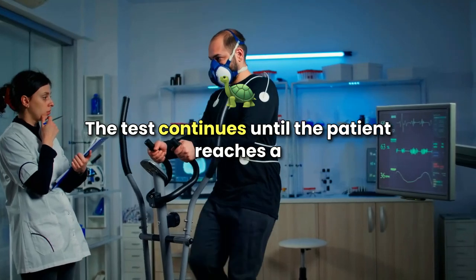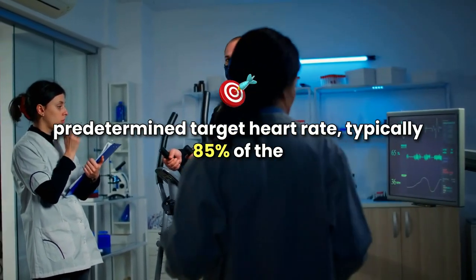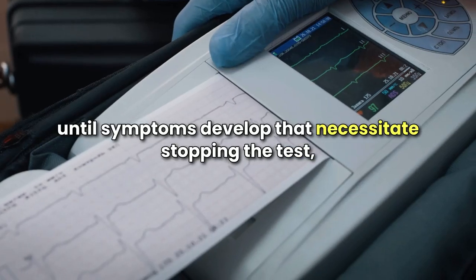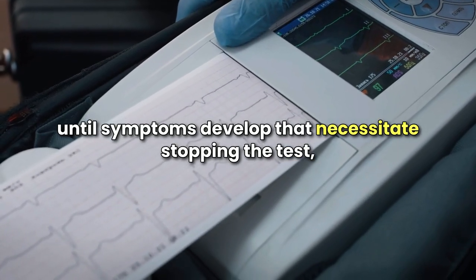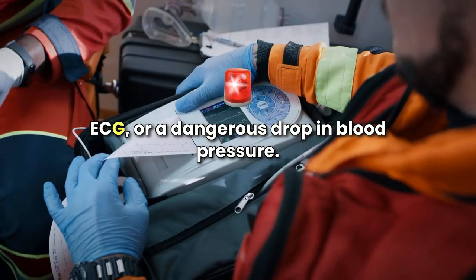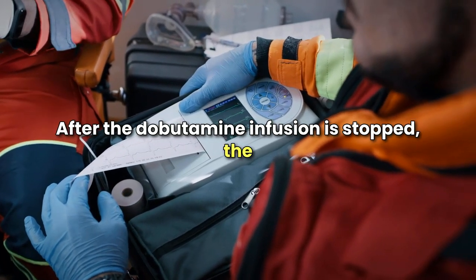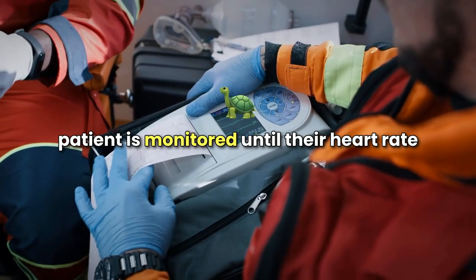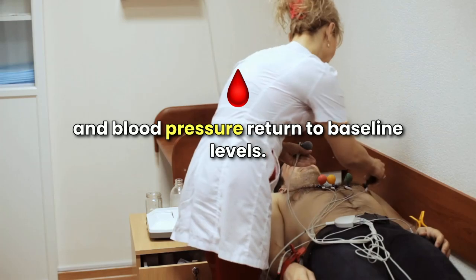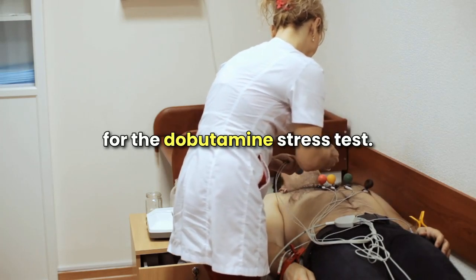The test continues until the patient reaches a predetermined target heart rate, typically 85% of the maximum predicted heart rate for their age, or until symptoms develop that necessitate stopping the test, such as chest pain, significant changes in the ECG, or a dangerous drop in blood pressure. After the dobutamine infusion is stopped, the patient is monitored until their heart rate and blood pressure return to baseline levels. Now, let's discuss the primary indications for the dobutamine stress test.